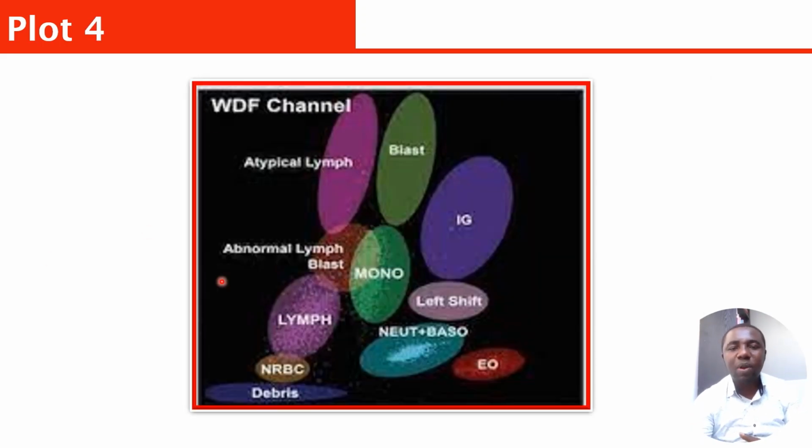So if you look at this plot 4, you are going to see that this is a white cell differential channel. It shows you that under the normal condition, you're going to see lymphocytes here, neutrophils here, and eosinophils here, okay? Then if there is a left shift of neutrophils, it can extend to this place, okay? But when you start seeing lymphocytes, instead of being here, run up to this place, you now know that you should be expecting atypical lymphocytes, okay?